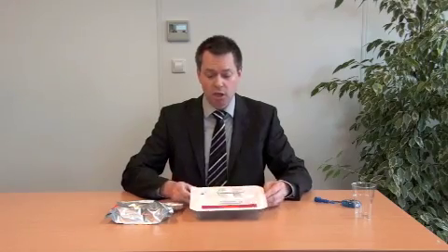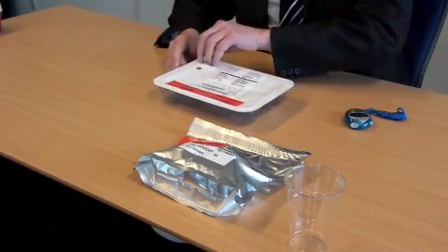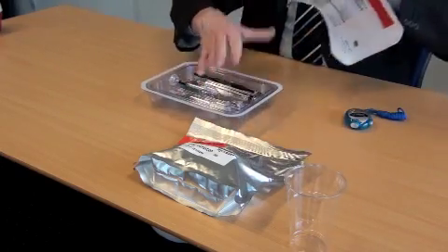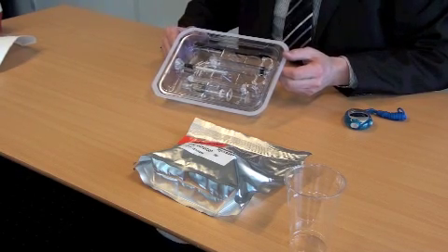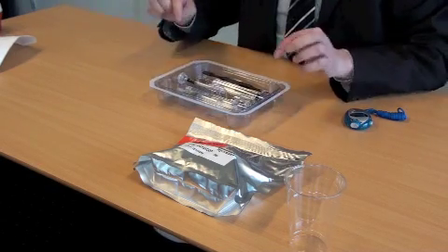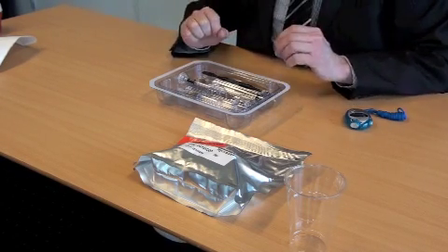I'm going to demonstrate right now the use of Hydroset 5cc sample. So in the box you will find this blister and you will find the pouch. Looking at the blister, when we open it, we will see that it contains the tray with the syringe, which contains the liquid, and all other instruments you need for the injection. It is the tray plus the instrument and the liquid that you take out and take into the sterile field.